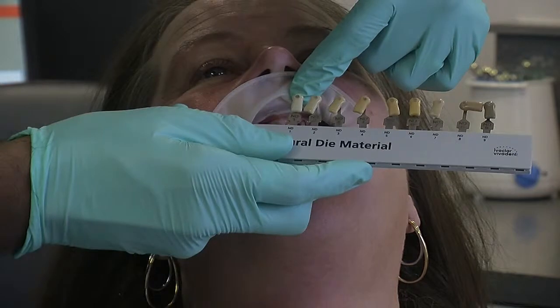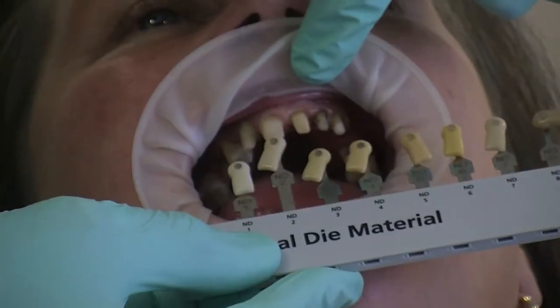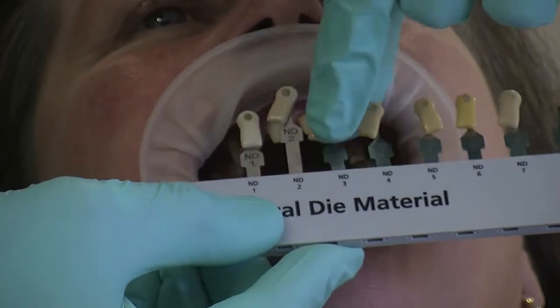For example, the upper right one is a bit lighter — that's closest to ND2. The upper left one is ND3.